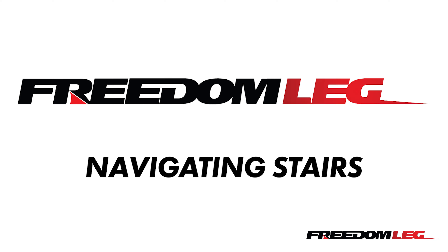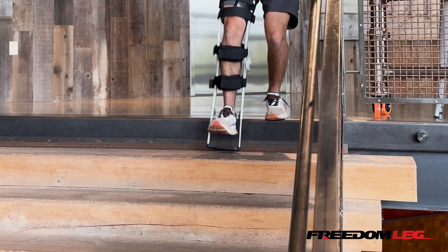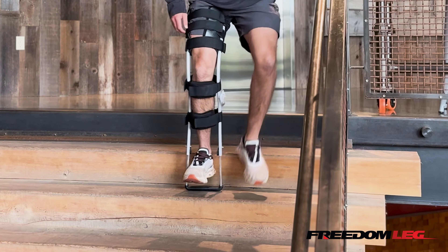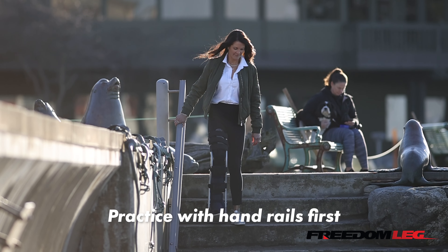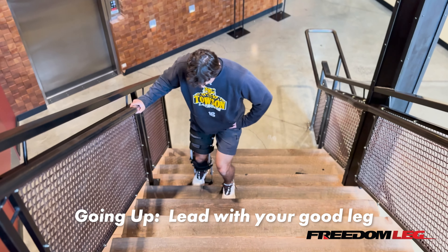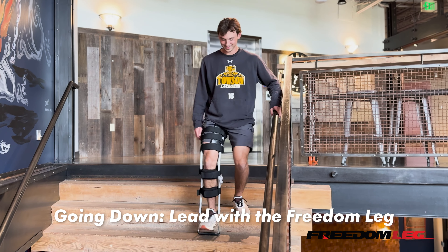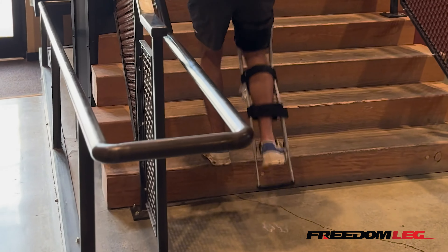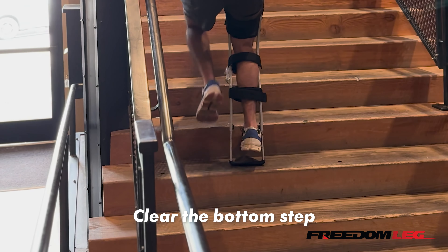Let's talk about navigating stairs. Always stop at the top of the stairwell for a moment — most falls happen after you've gotten comfortable and started thinking about other things. Practice on a stairwell with handrails first. The great news about the freedom leg is that you can use both hands. On the way up, you're going to lead with the good leg. On the way down, you're going to lead with the freedom leg. Be careful to clear the step with the freedom leg on the way up so that you don't catch it and trip.